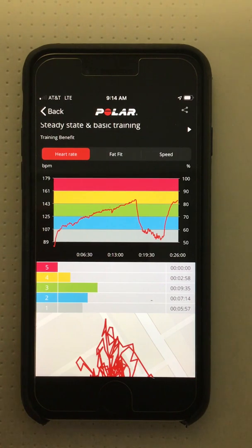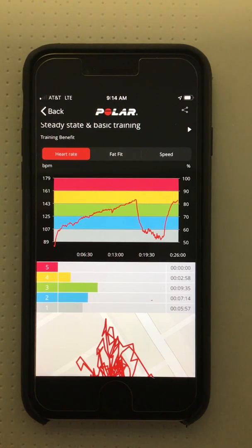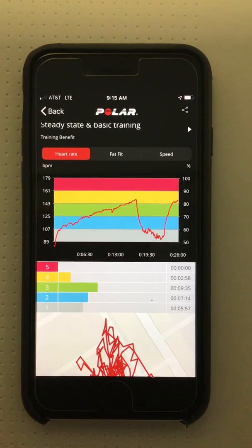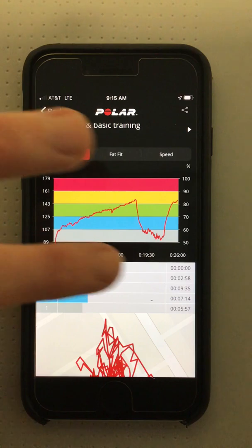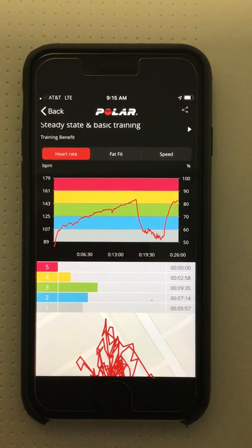Looking below at the bar graph, I can see how many minutes this patient spent in each of the training zones. The gray bar indicates how much time he spent in the low intensity zone, or less than 60% heart rate max — he spent five minutes and 57 seconds in this training zone.